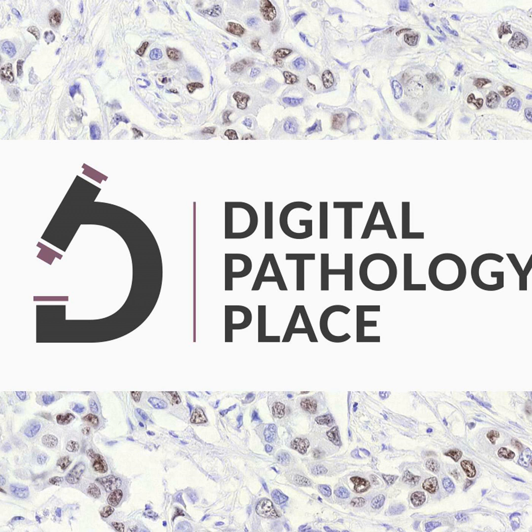However, the use of AI in pathology is not limited to image analysis. With the development of sophisticated large language models like ChatGPT by OpenAI, AI is beginning to transform other aspects of pathology as well. One such area is pathology reporting. Traditionally, pathologists generate text-based reports outlining their findings, which can be a complex and time-consuming task. AI models can assist in streamlining this process by helping to generate preliminary reports based on the pathologist's notes, voice recordings, or potentially even directly from the analyzed images.